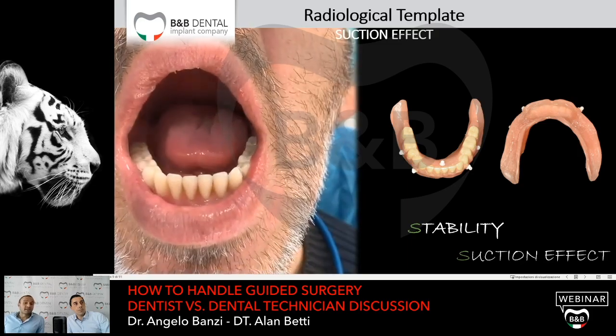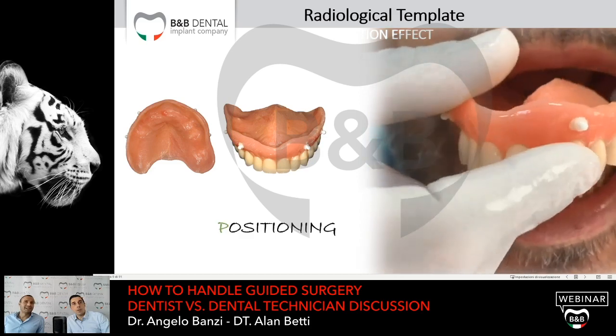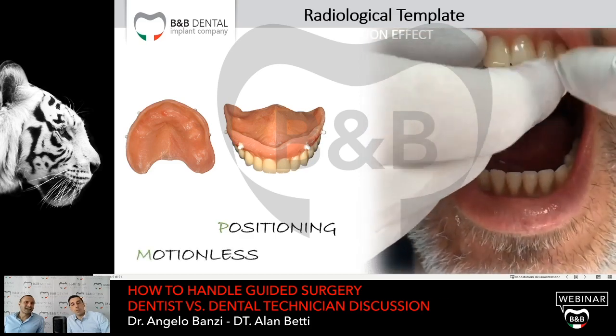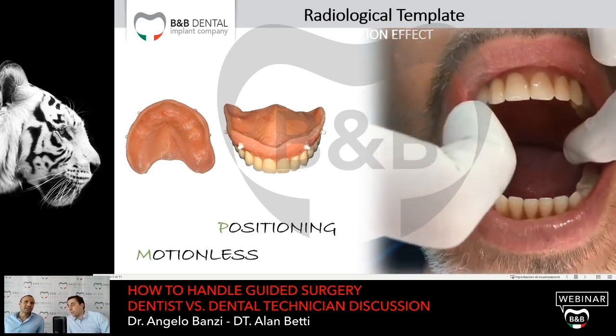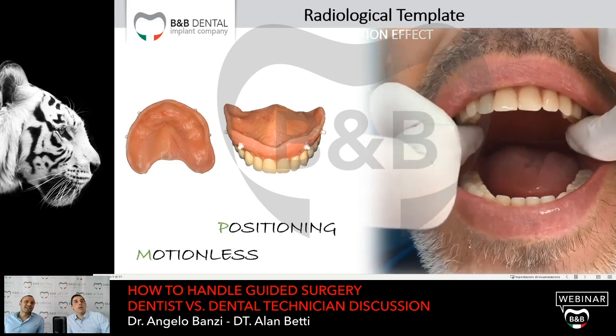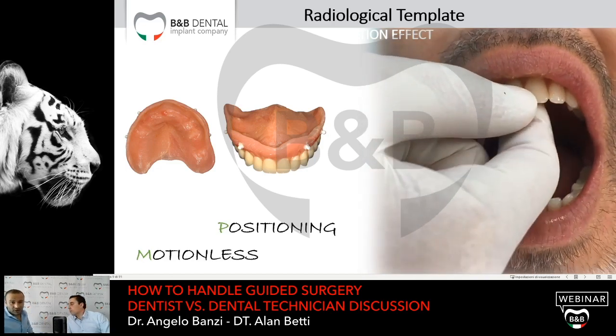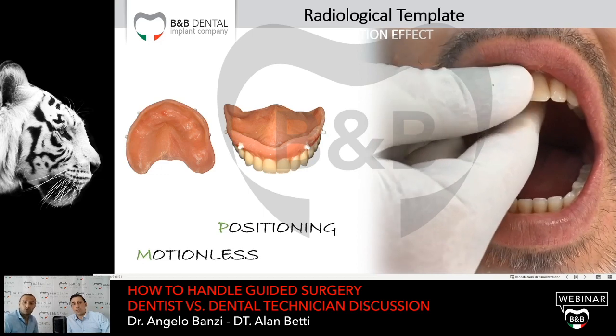Well, actually, it's difficult to remove from the mouth of the patient, and this is a very important point, because everything starts from the impression, and the impression has to be good.